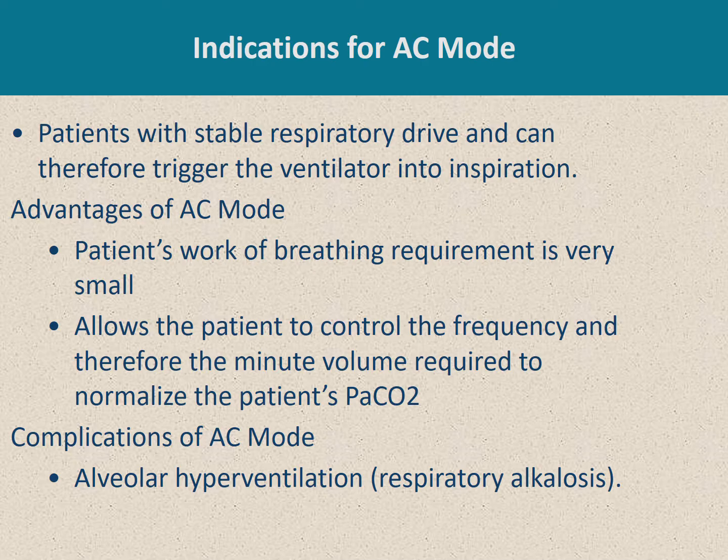Complications: if the patient is hyperventilating and every breath is given by the machine, the patient can easily develop respiratory alkalosis.